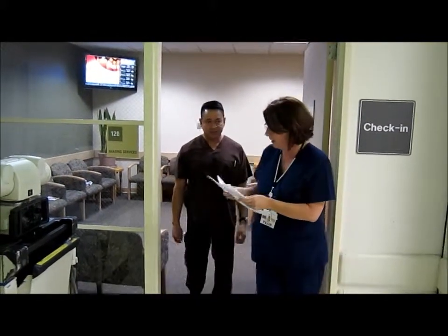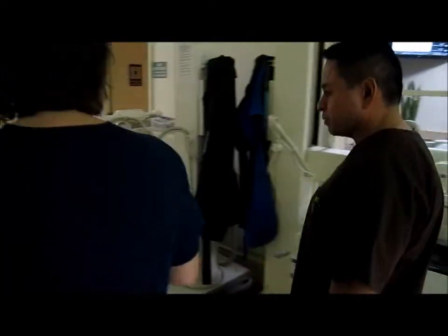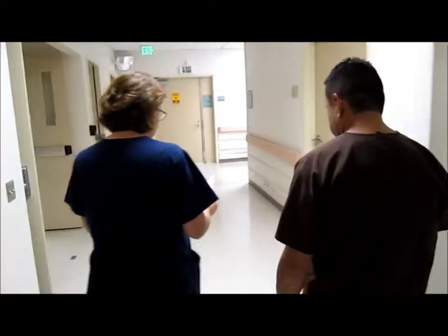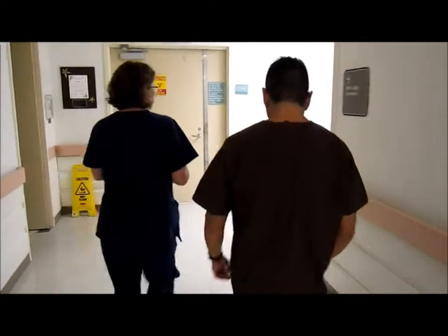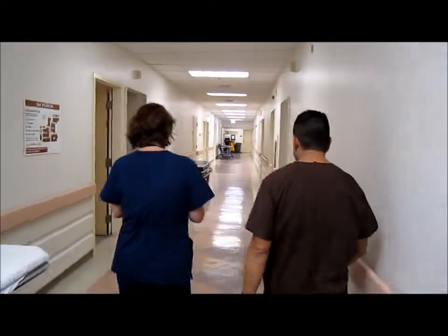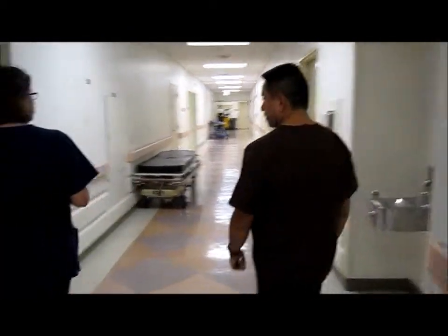My name is Fran. Can you tell me your first name and date of birth? Tony Bodine, and it's 11/20/1965. Dr. Smith has ordered a knee X-ray for you. How did you injure yourself? Running. I got my foot caught and I felt it pop, so it's been hurting ever since.